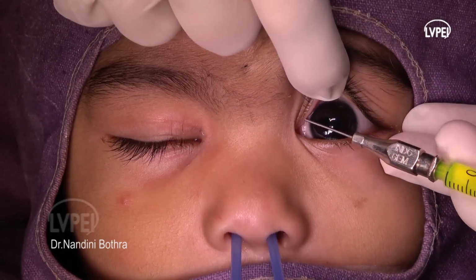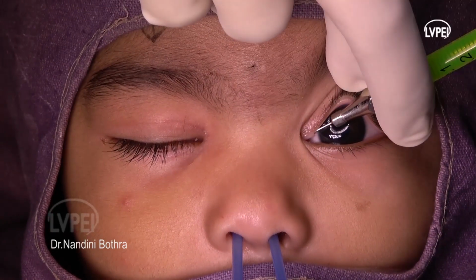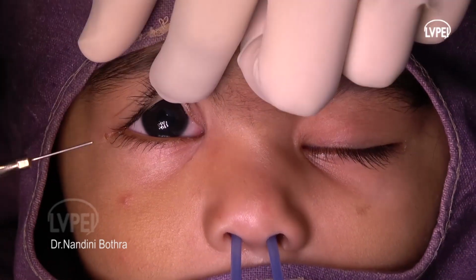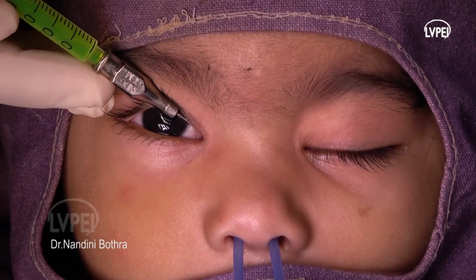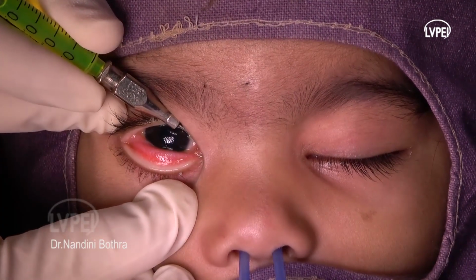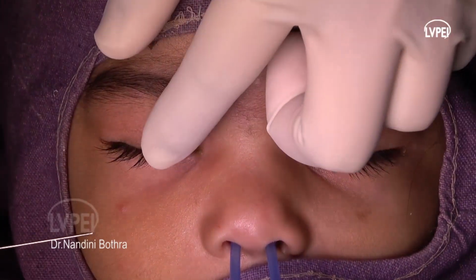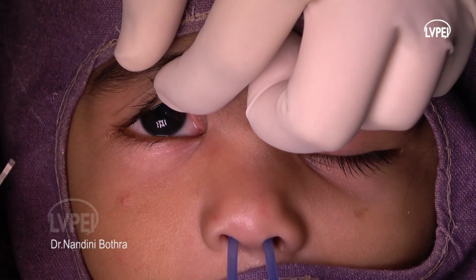Irrigation is performed using a 1 ml syringe and a 23 gauge straight cannula to confirm the nasolacrimal duct obstruction. Bowman's lacrimal probe using age-appropriate size is then used in a similar way.